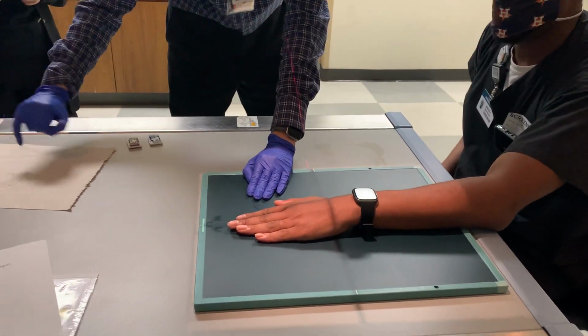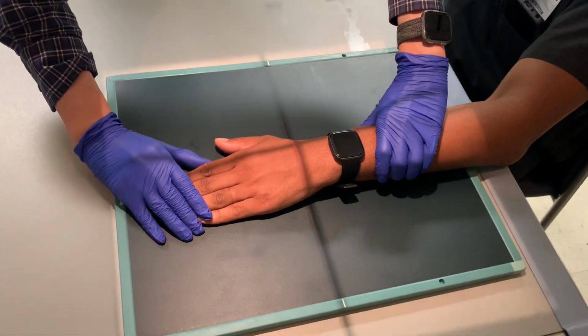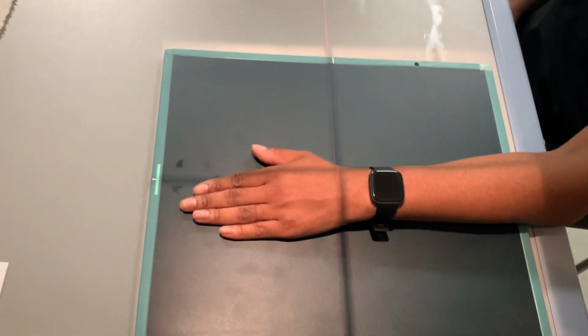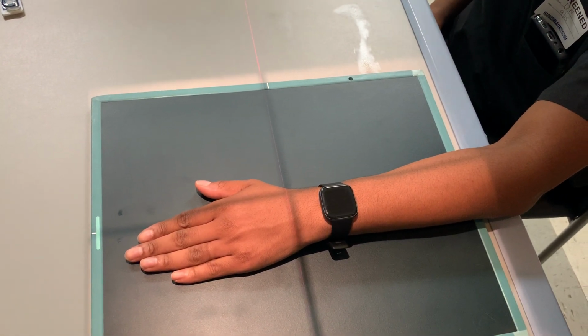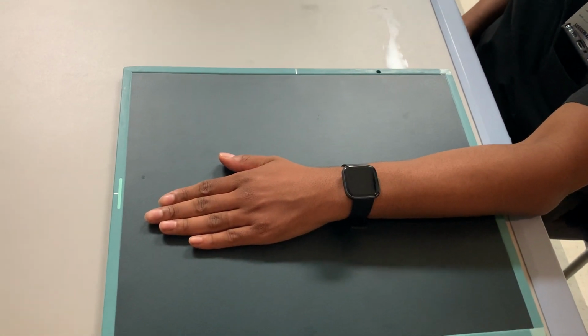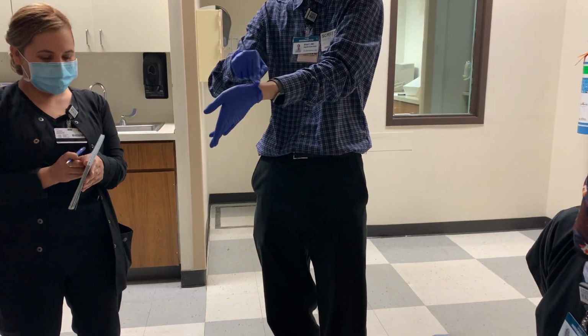So, as you can see on this picture, we are aiming for the scaphoid that's going to be right here. Okay, so we're going to center on the scaphoids slightly. If you look in the book, it also says that you can look for that styloid process. So if you feel the thumb side of your forearm, just feel this all the way up. You'll feel this bump right here before you get to the wrist.